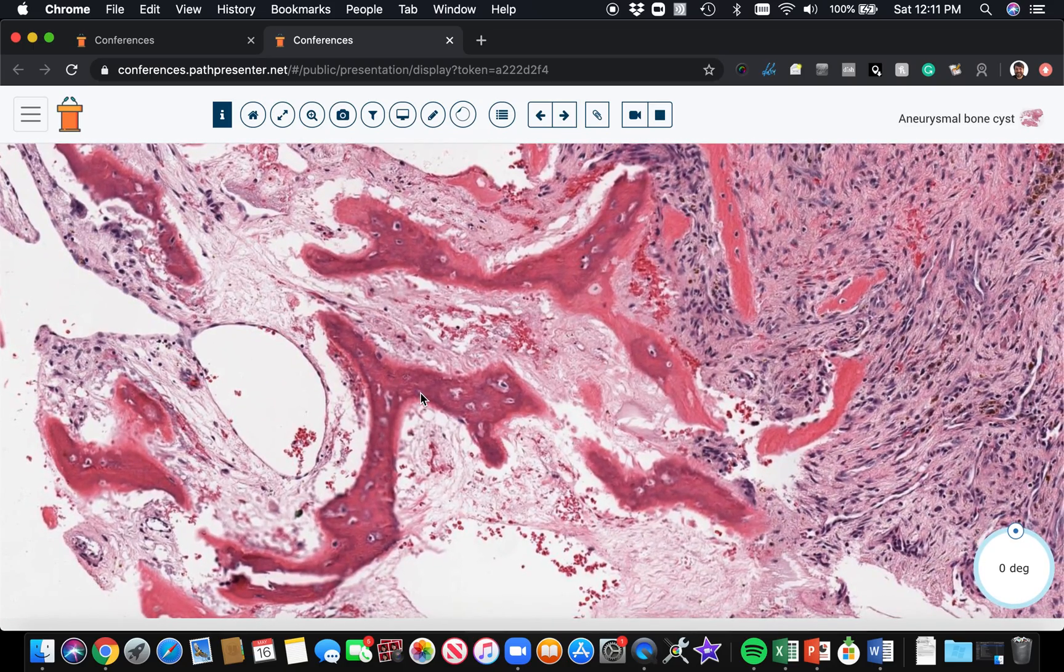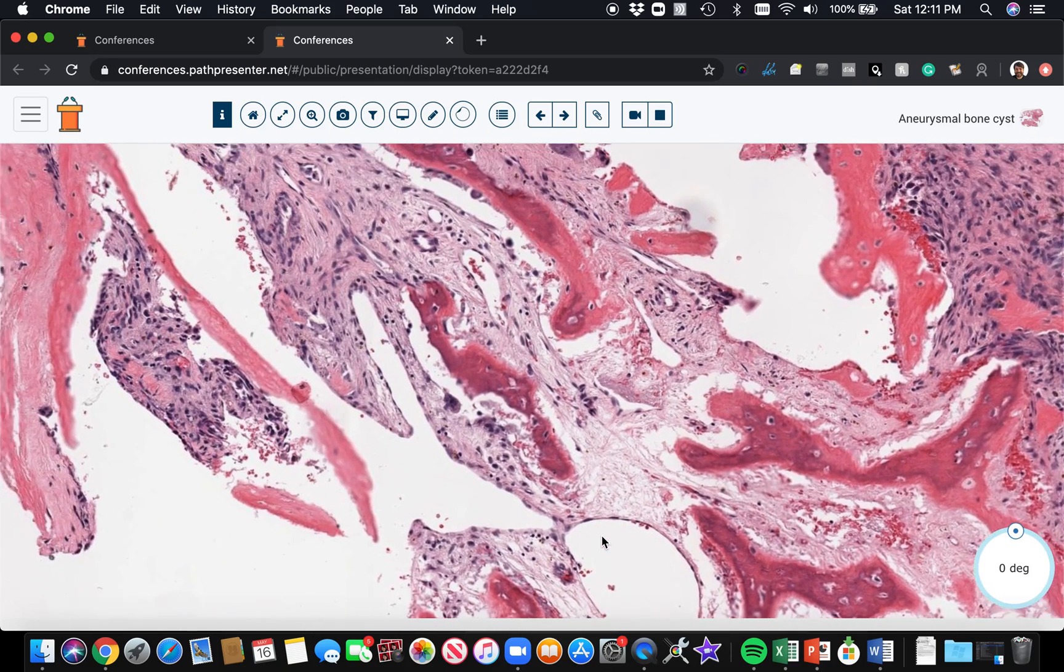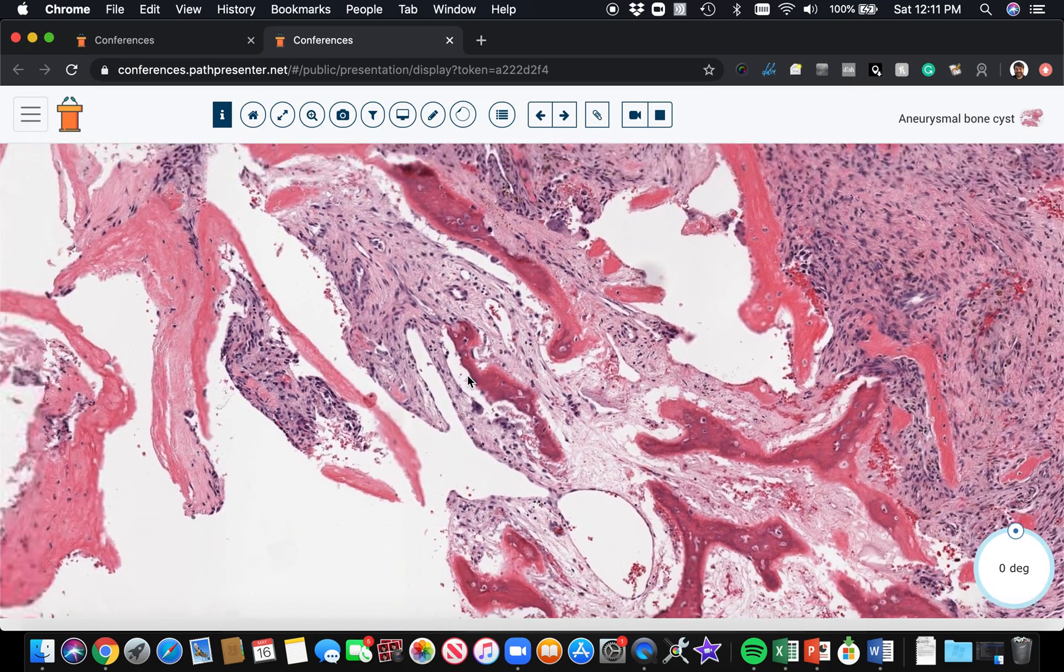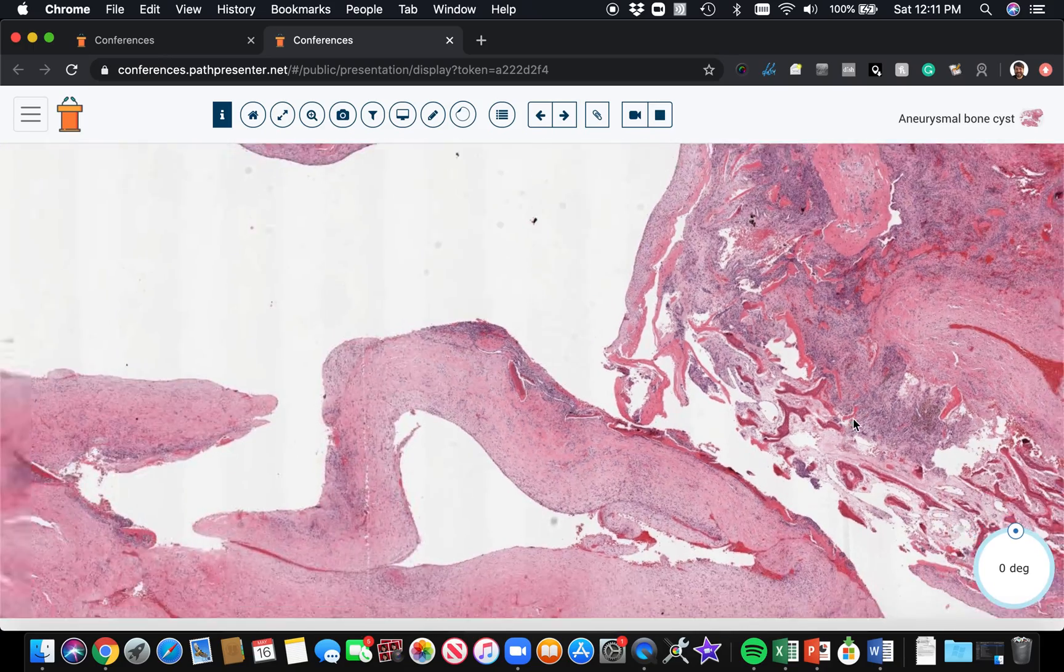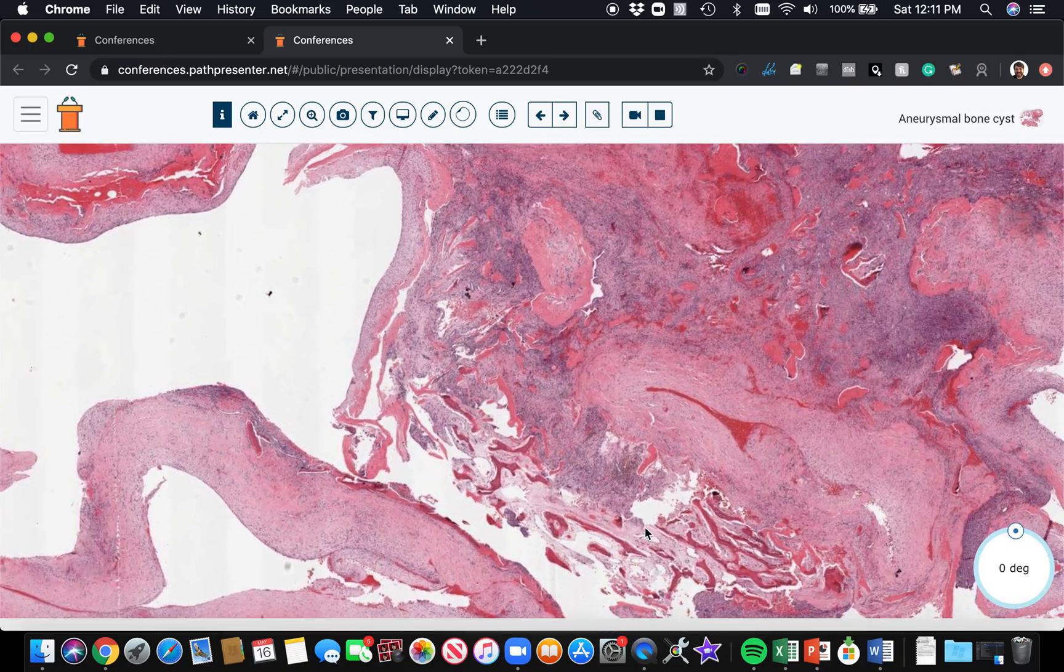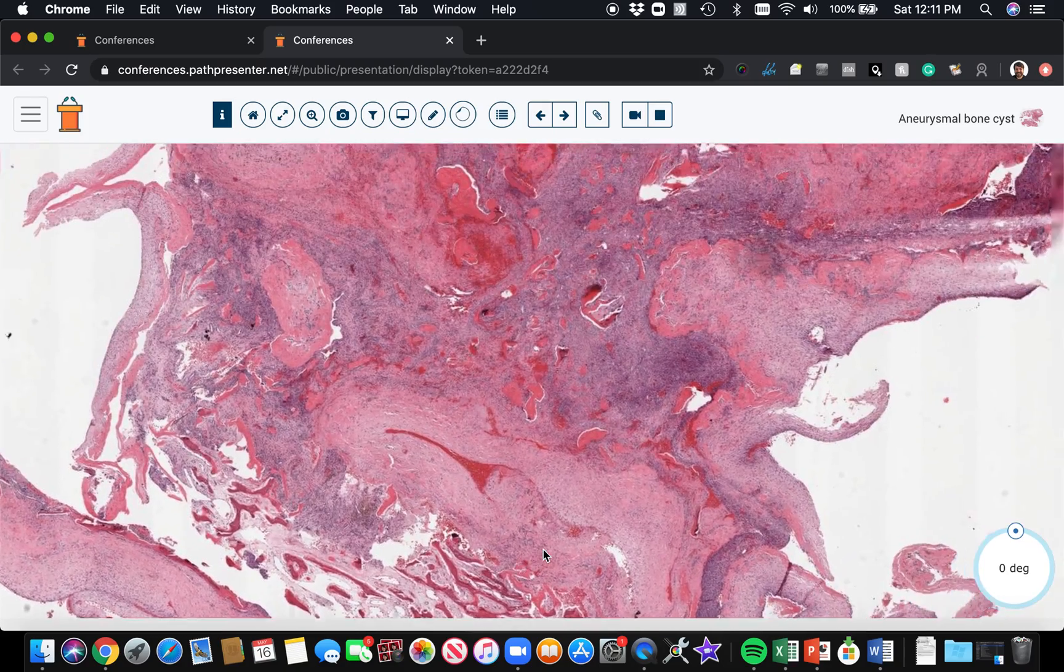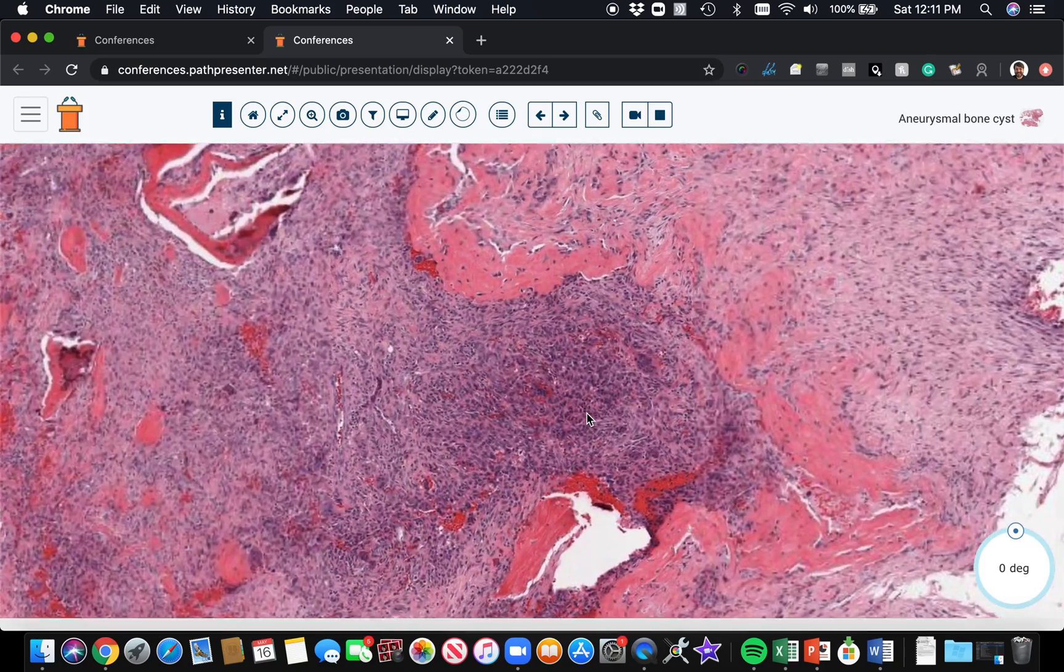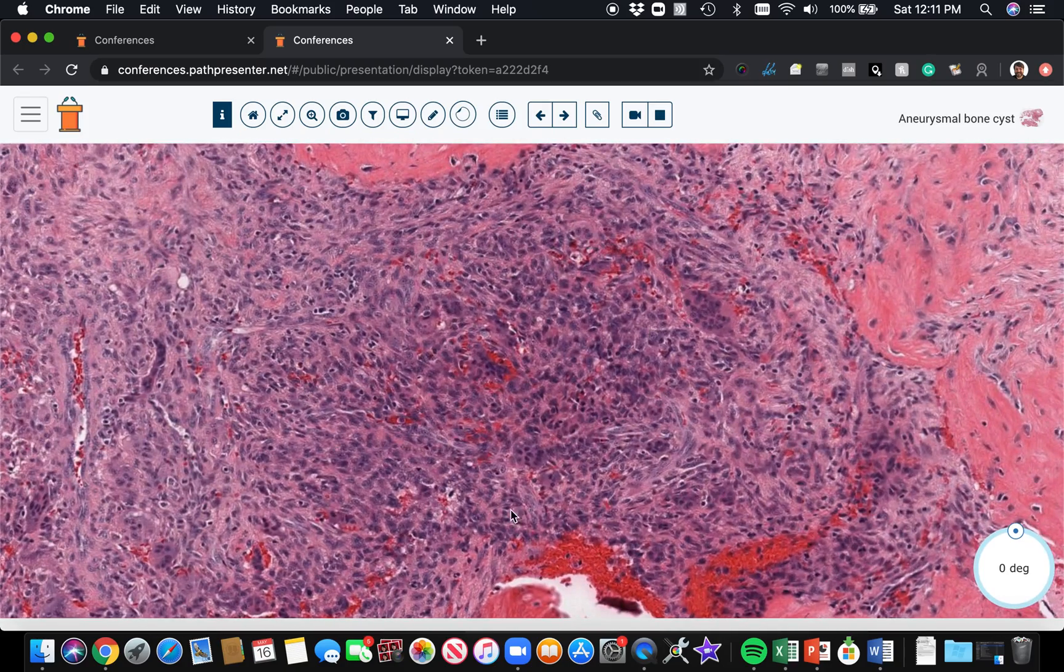So woven bone is always a sign of new bone formation, so it's basically always a pathologic process - not always malignant, but it's always abnormal to see woven bone, at least as far as I understand. Okay, so the - oh yeah, there's one other thing I wanted to show you.